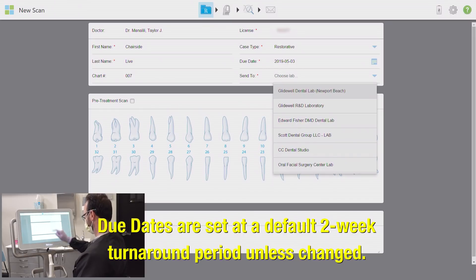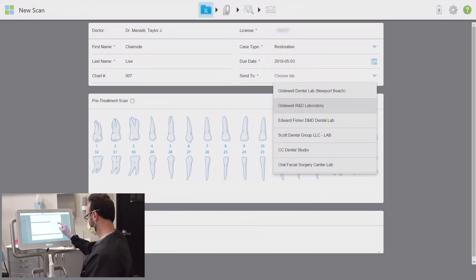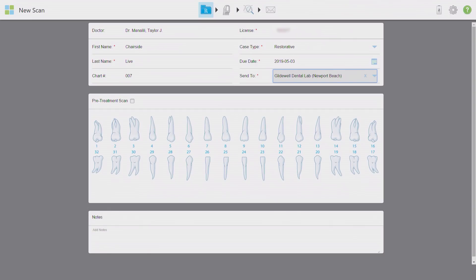The iTero will automatically suggest and highlight a two-week turnaround time unless you specify a rush case and change the due date manually. Under the send-to menu, select the lab this will be delivered to. For today, this scan will be headed to my home base, Glidewell Dental Lab in Newport Beach, California.